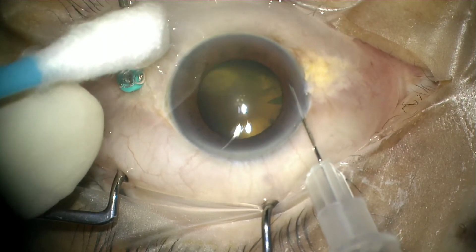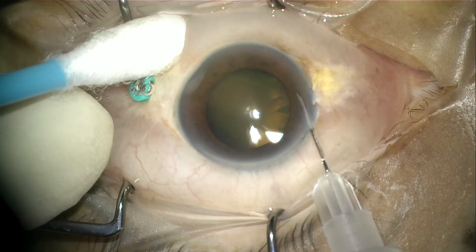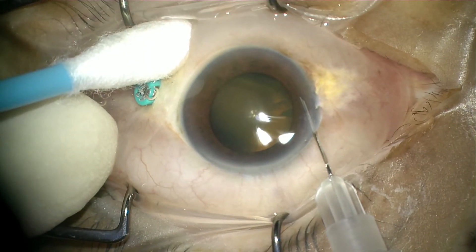We start with cleaning the eye with povidone iodine. I always put a drop of 5% iodine into the eye at the same time.